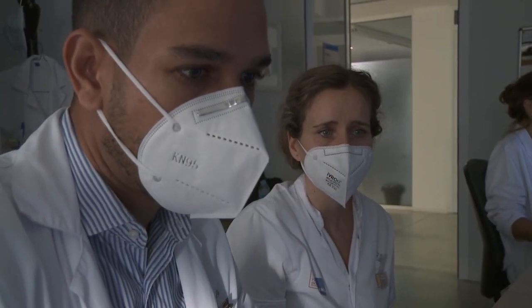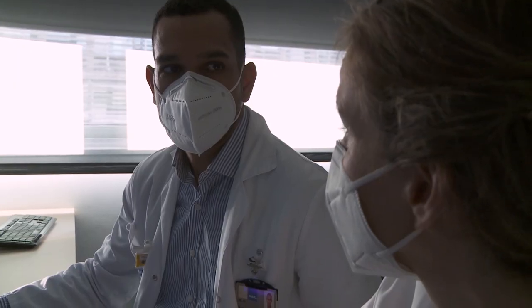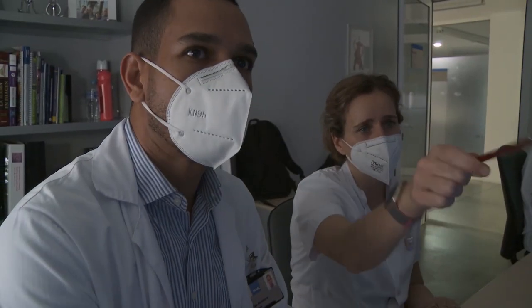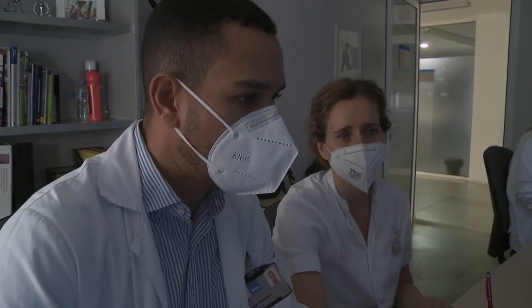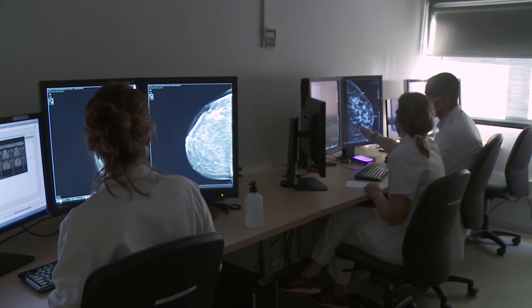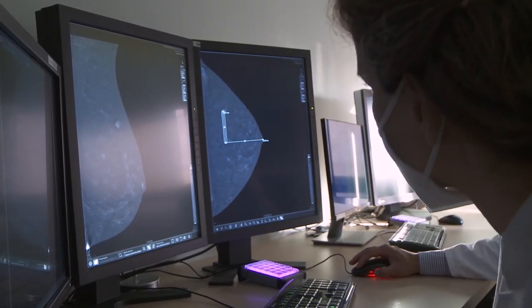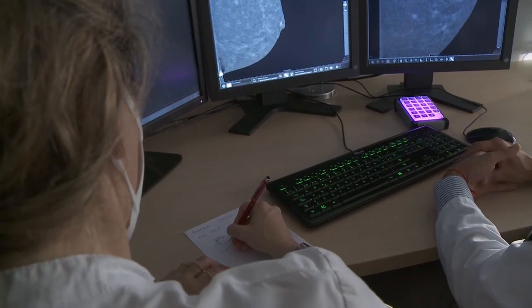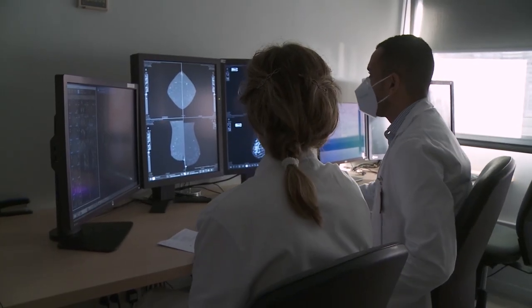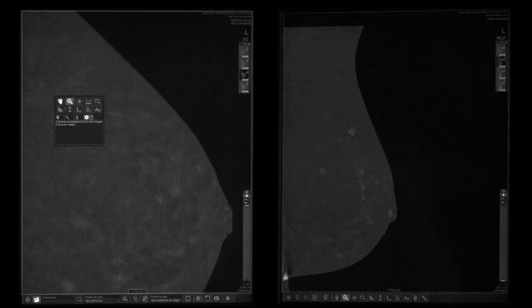When performing a biopsy, it's essential that both the radiologist and radiographer carefully review the case in advance, together. There is also one golden rule. Try to use the projection which gives the best view of the lesion, and also the access route with the shortest distance from the skin, making it as comfortable as possible for the patient. This will facilitate targeting, optimize timing, and therefore increase success rates.